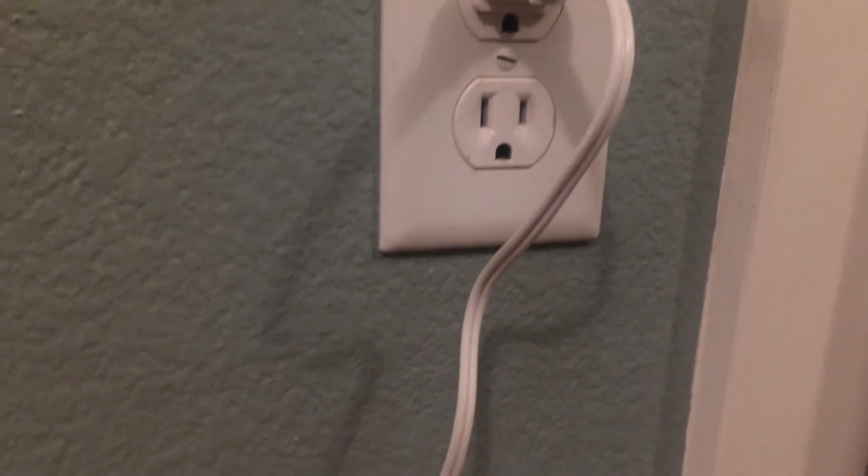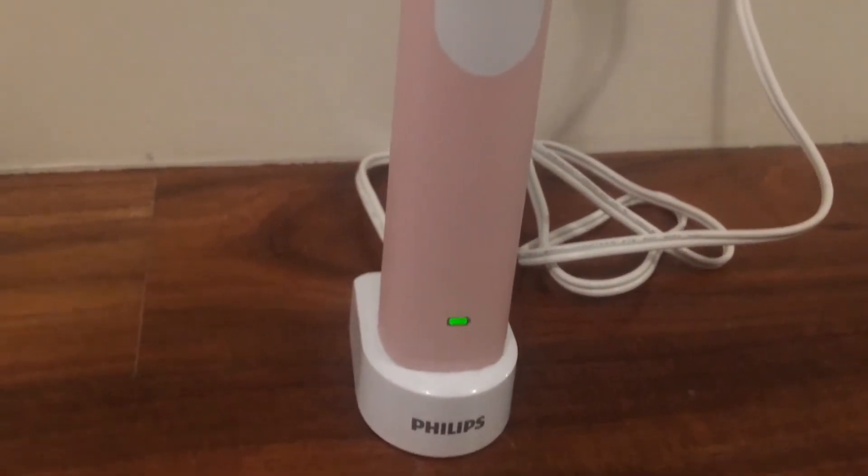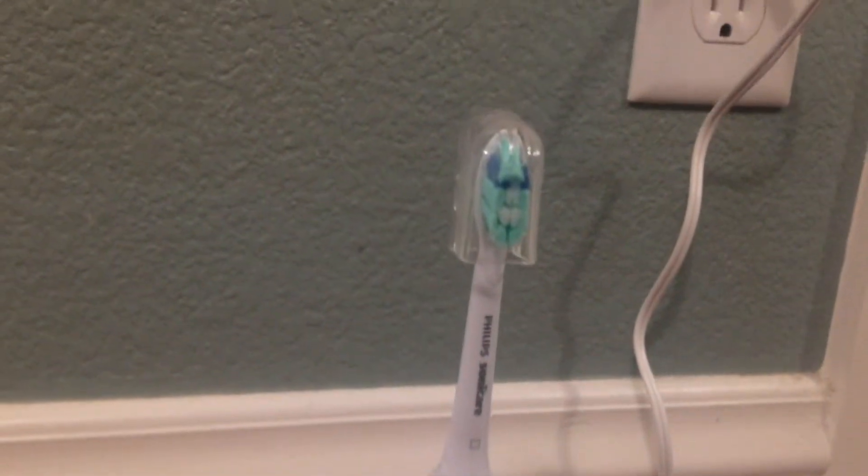What's really cool about these toothbrushes is that all you have to do is plug them into their charging station. Once you do that, a green light should come on. And when you are ready to brush your teeth, all you do is remove them from their charging station, take off the cap, press this button, and you're ready to go.